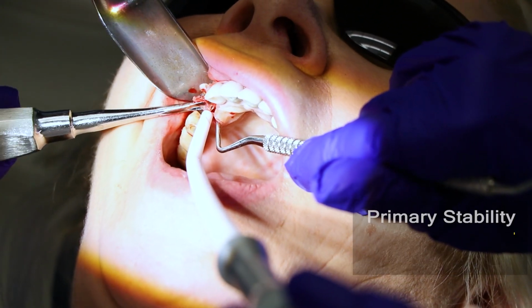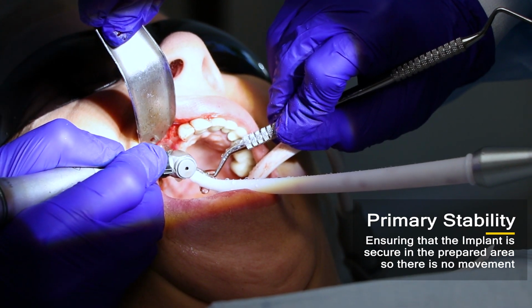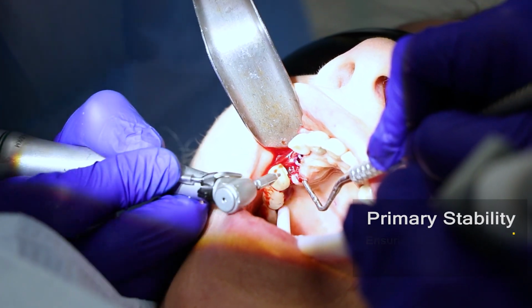I try to under prep a little bit when I'm doing an immediate placement. This means that I don't use the final drill to length, or I don't use the final drill at all. And this is so that I can get good stability on that implant.